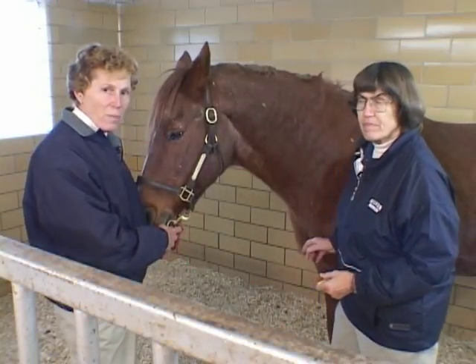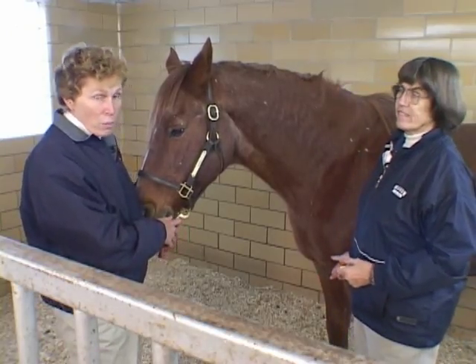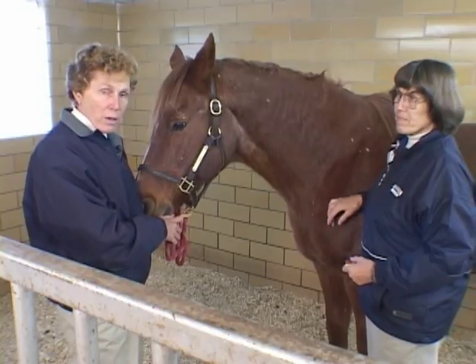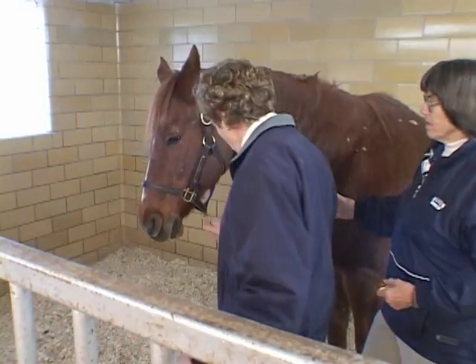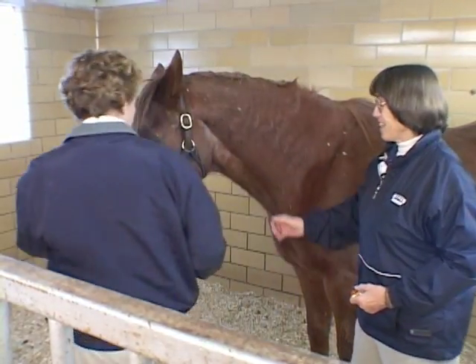One of the problems a neophyte has is they don't see the vein right away, then they change location and don't wait long enough, and so they just get a warped picture. It's good to be patient. Dr. Hamill is going to show us two different ways to draw blood from a horse, but before we get started I'd like to spend a moment on restraint and safety. We chose Red because he's a really good guy and not likely to misbehave. If I was working on a client horse, I'd be standing to the side so I'm less likely to get hit by a front leg or take his head in my face, and I'd still have room to work.